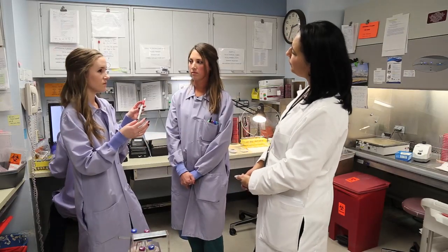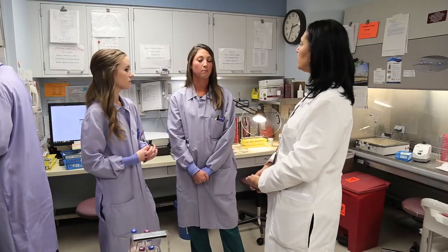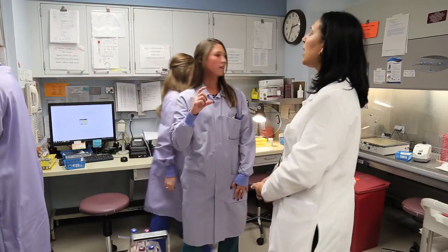Why is that? This doesn't sustain the anaerobic. So the swabs don't allow some things to grow. Is that right? Correct. Yes, the anaerobes will die off very quickly. So that's why those other tubes she's talking about have a gel medium in the bottom. Okay.